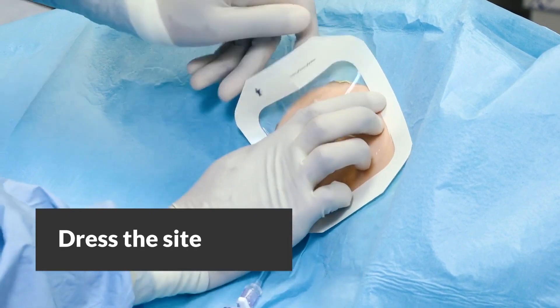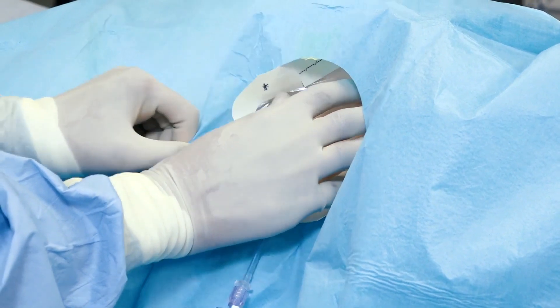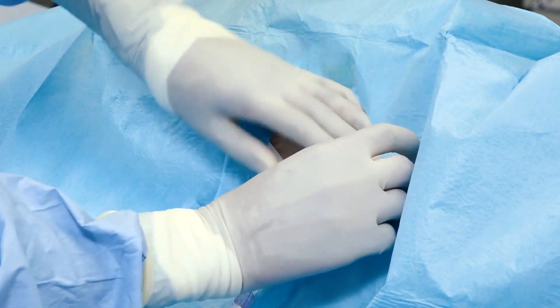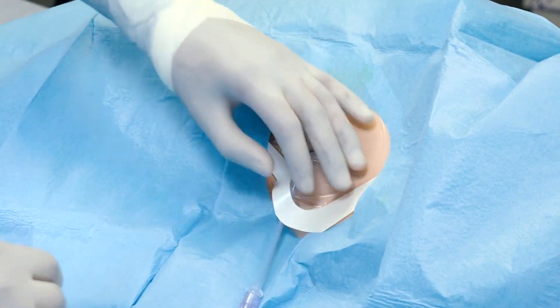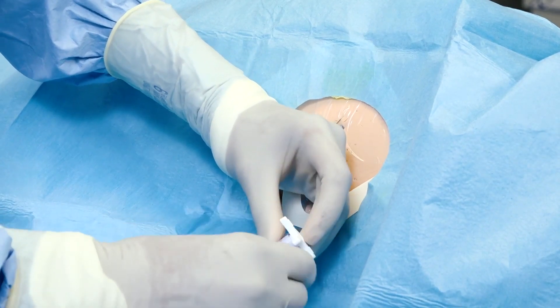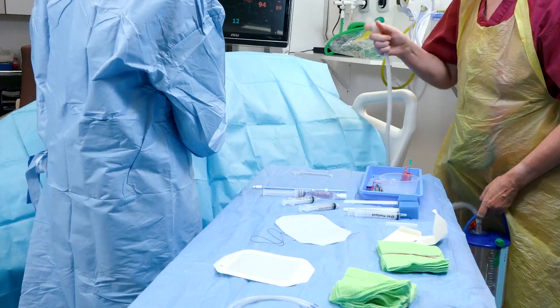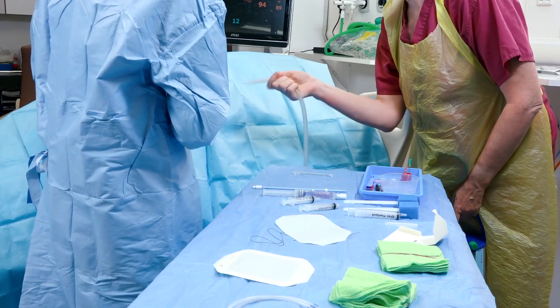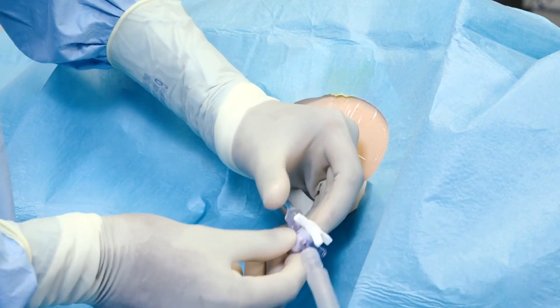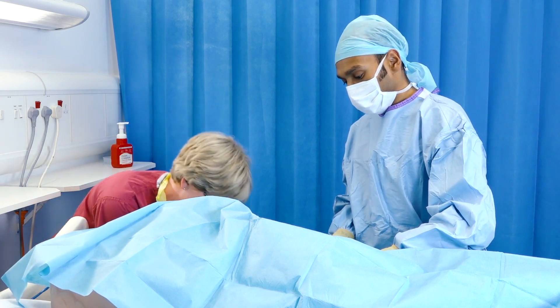Next, cover the insertion site in a transparent dressing, as per your local hospital policy. Attach the drain tubing to the pre-assembled drainage system. Be aware of the specific drainage systems used at your hospital.